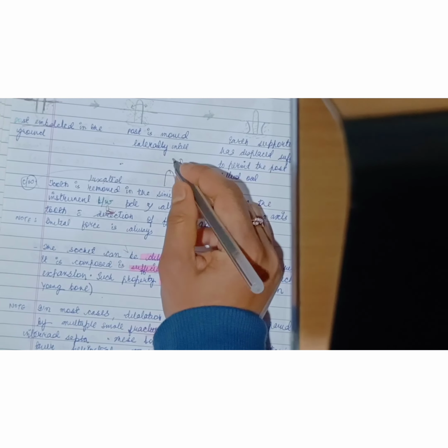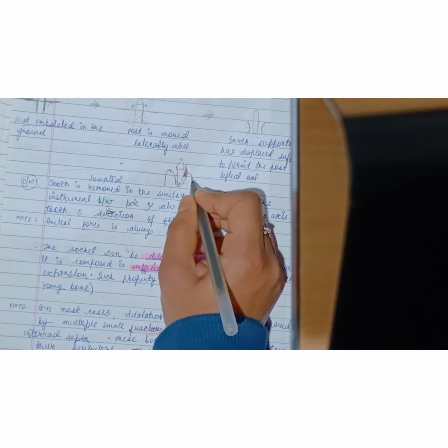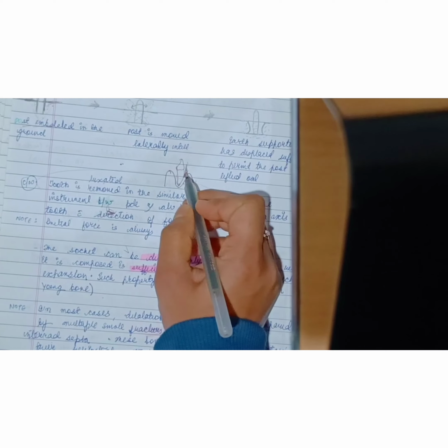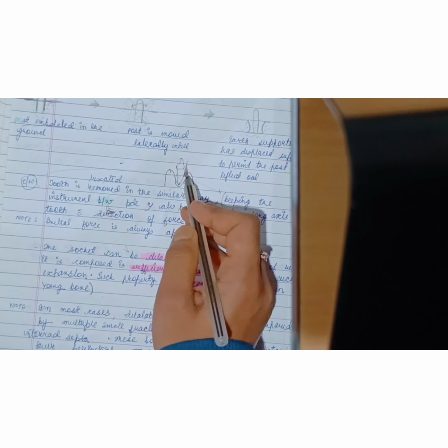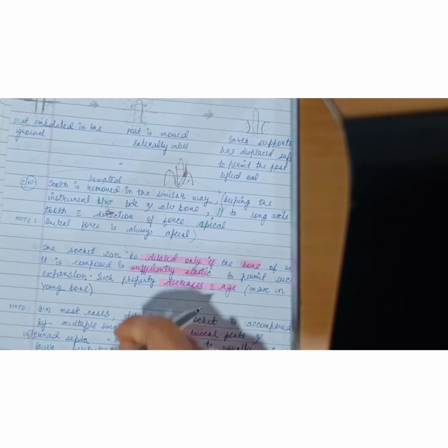We will apply the force in the apical direction and we will keep the instrument between the PDL and the bone. This is the bone, this is the PDL space. We will keep the instrument between the bone and the PDL space parallel to the long axis of the tooth, and we will apply the force. The first direction of the force is always apical, remember.